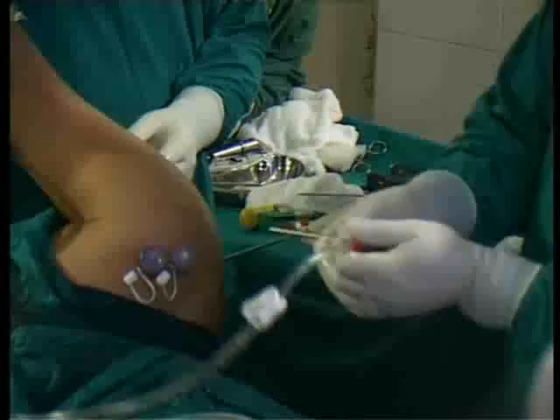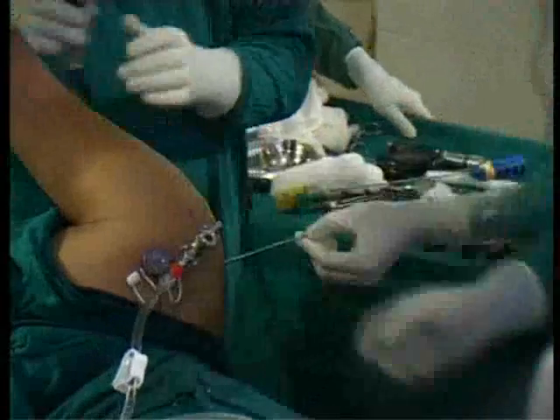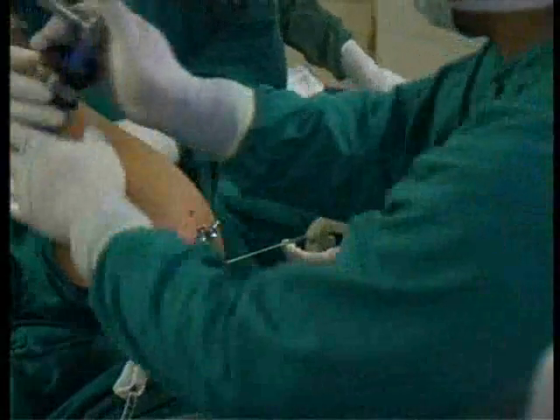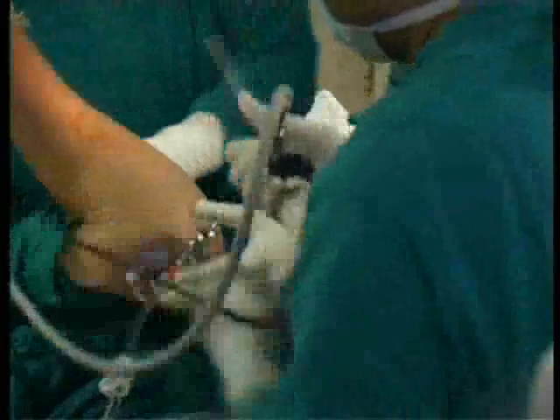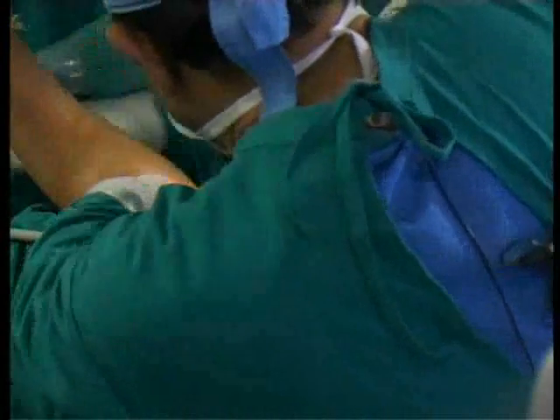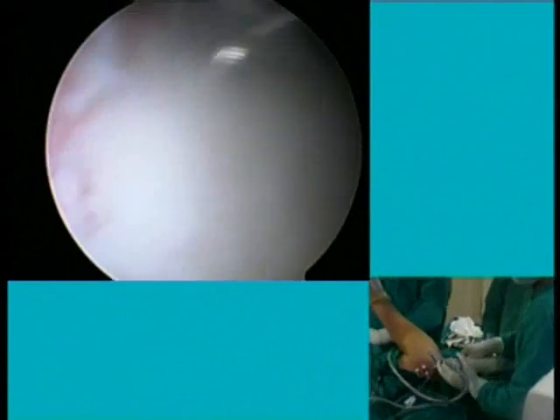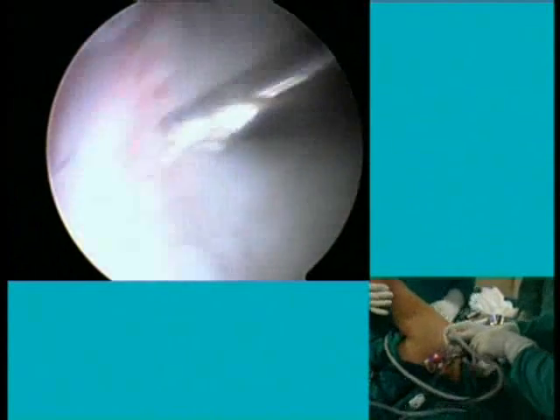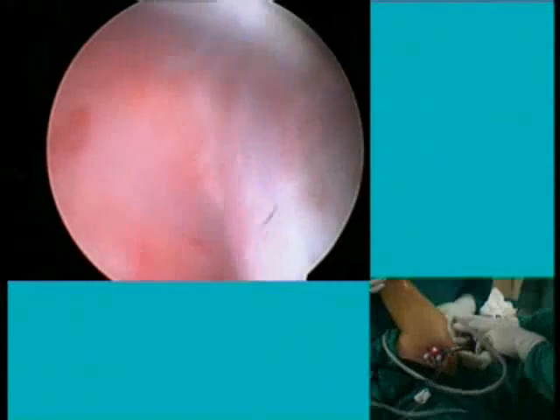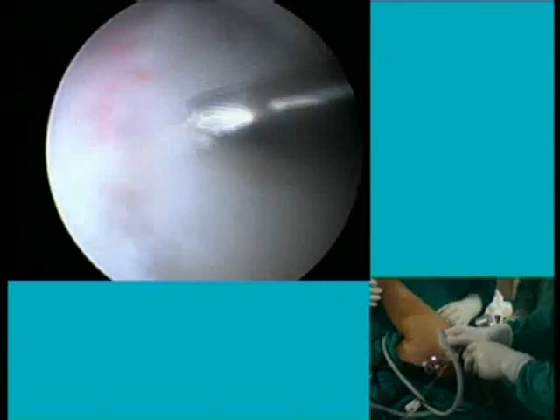Right. So I have put a Wissinger rod in my posterior portal, and now I have shifted my scope into the anterosuperior portal to have a direct view of the anterior rim of the glenoid. Hopefully that will give a better view of the labrum, and I can have a better position to view this area, where a stitch taking the capsule along with the labrum will help me. Yeah, that's a very good view.